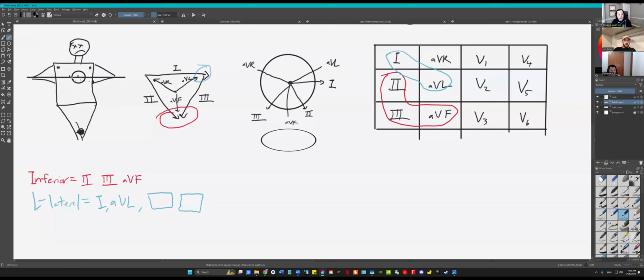With the precordial leads that you put on a patient when you're doing EKG tracings, V1, V2, 3, 4, 5, 6, if you take this circle and tilt it 90 degrees, and imagine this sitting on a plane, it would look like this. V1, V2, V3, V4, V5, and V6, which is perfectly horizontal.